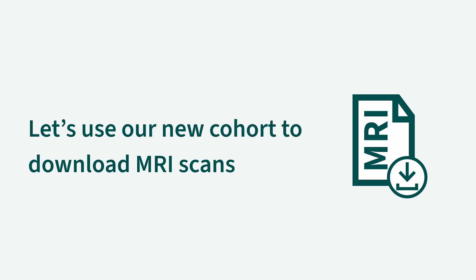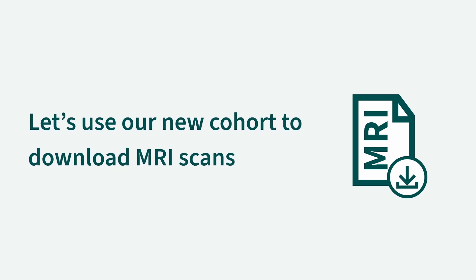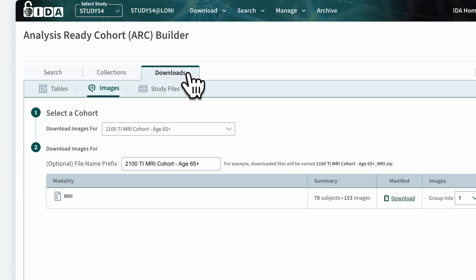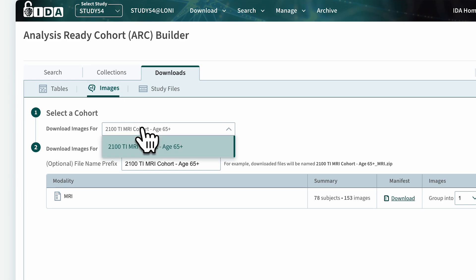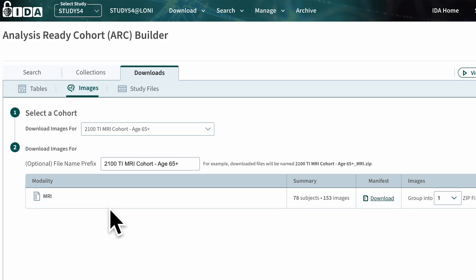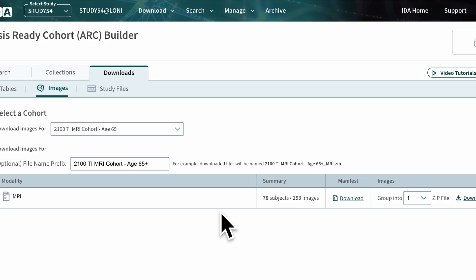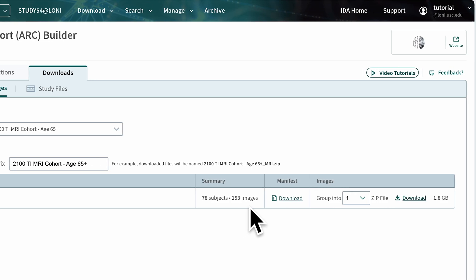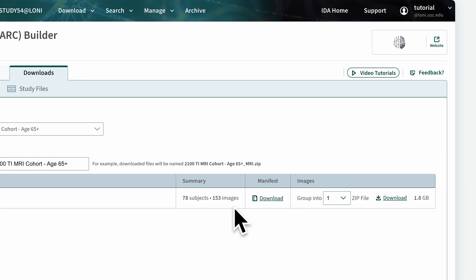Next, let's use our new cohort to download the MRI scans. In the Download section, navigate to Images and choose the name of the cohort from the menu. Note that the Download table only contains modalities specified by the filters that define the cohort for your subjects.